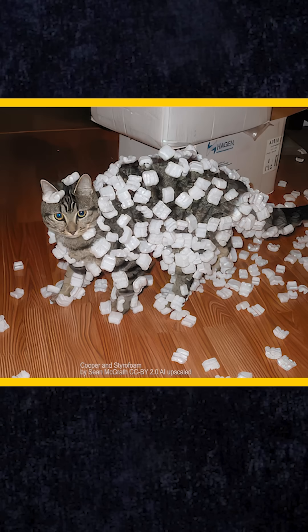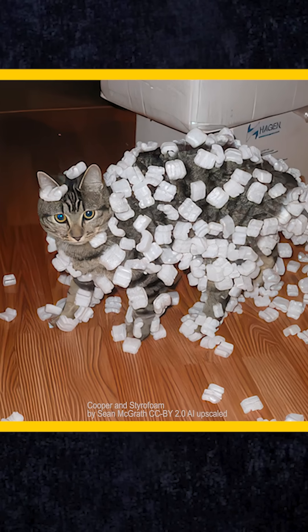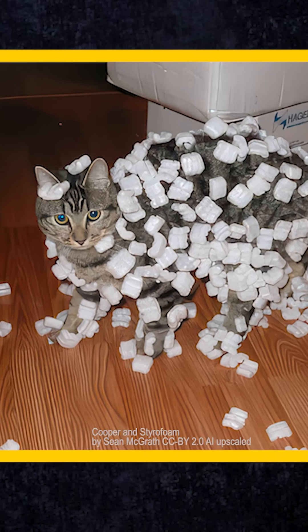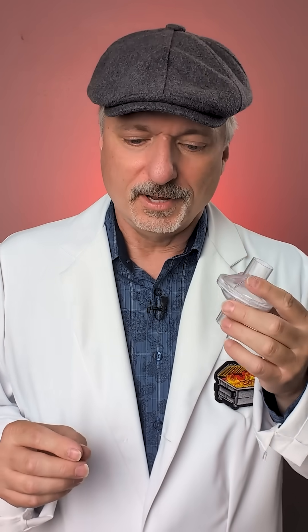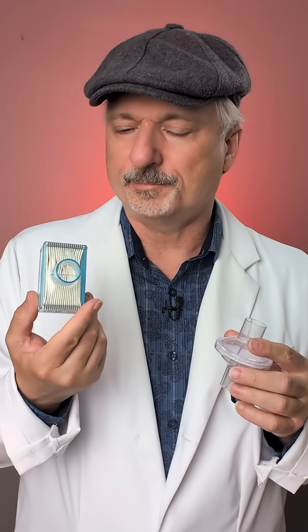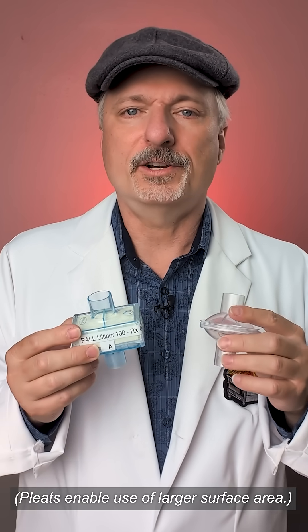Why does the static charge of the filter media matter? Well, this picture of an internet-famous cat explains. As you can see, it's covered in styrofoam packing peanuts, and that's because of static electricity. Filter media can use the same exact principle to capture extremely tiny particles. That's not the only mechanism by which filter media captures particles, but it is very efficient and lets you have small filters that can do the same work as much larger filters with a lot of pleated area and have the same pressure drop. It's a good thing, and it's used in N95s and a lot of other very efficient filters.